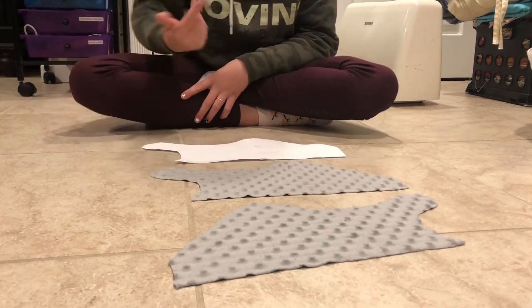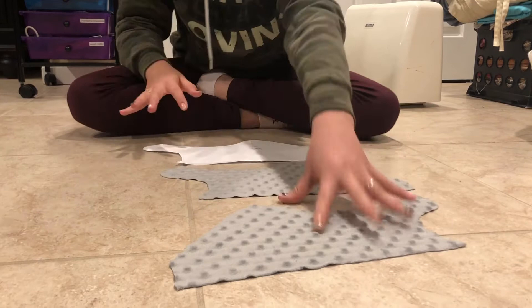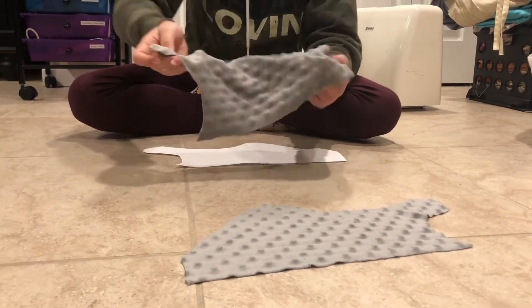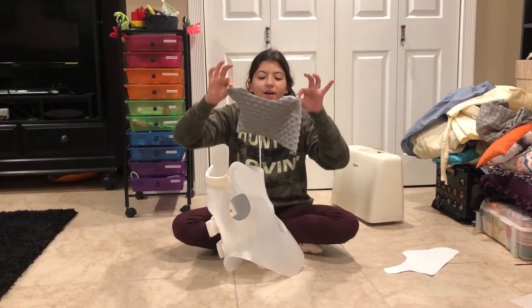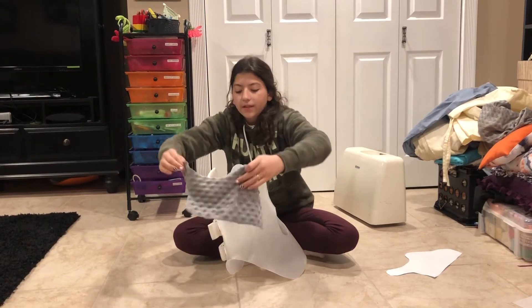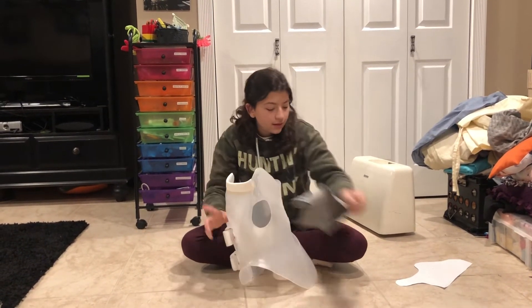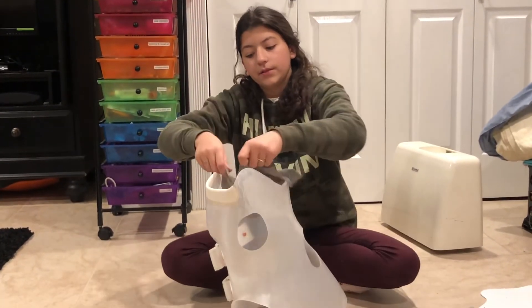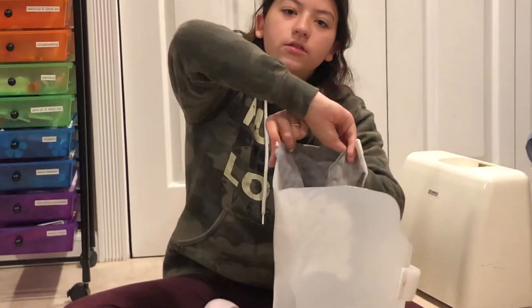As you can see, I cut mine out. These are two different sides — there's a nice side and a bad side, so that's why I cut it out differently. But if yours isn't like that, that's fine. As you can see, this piece fits perfectly on one side of the brace, and then this piece fits perfectly on the inside, on the opposite side of the brace.